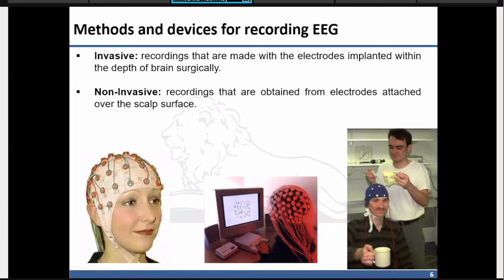We just use these wearable sensors, and these electrodes are connected, and that's it. We will get the signals. Now in those brain scalp devices, there could be a range of electrodes. In some devices, there could be one sensor, electrode, there could be two electrodes. There are some sensors with 32 electrodes, 64 electrodes, like this.